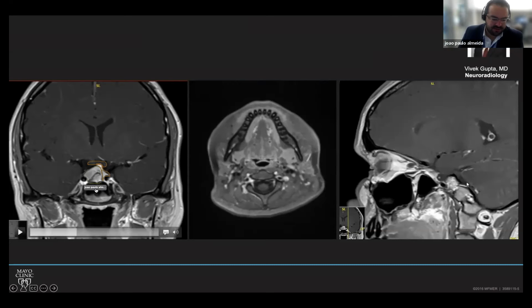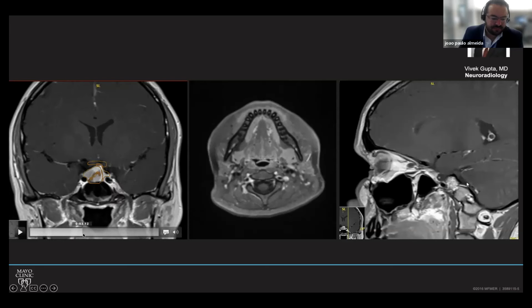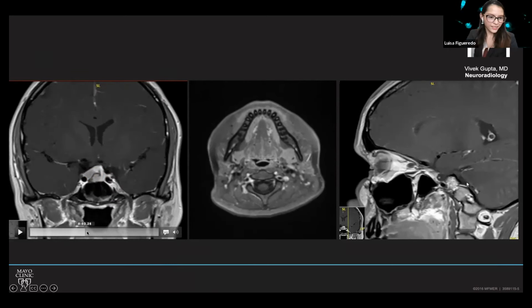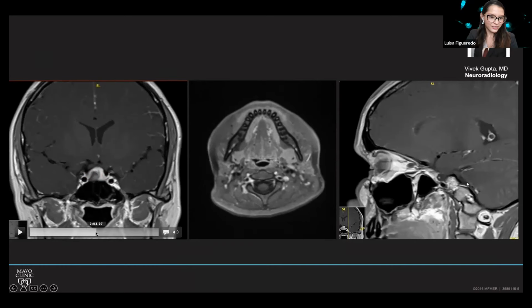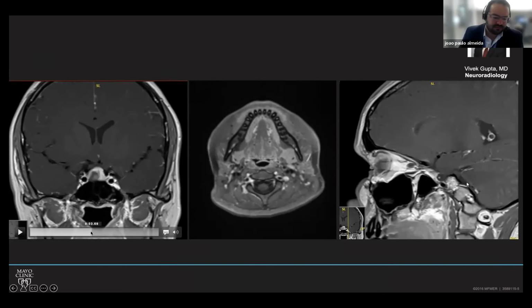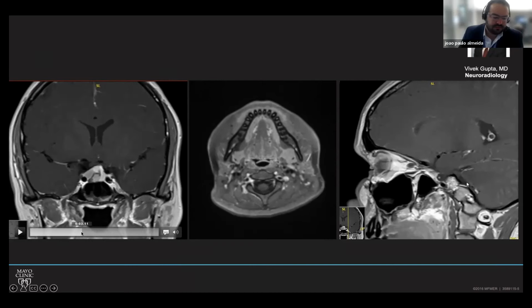What is interesting in this tumor is this. To be fully honest, I don't know what to make of this hypointense signal tissue here. Would you scroll this image a bit more just so we take a look at the cavernous sinus? Yes, sir. Go back and forth. I think the cuts are a little bit thick, and then we're just losing it. Go back now. Okay, I mean, that's fine.